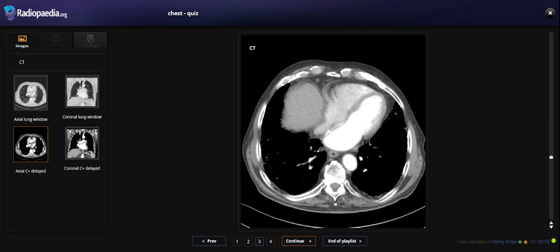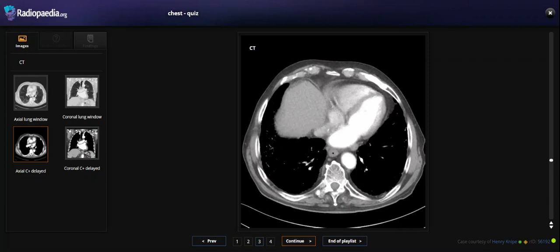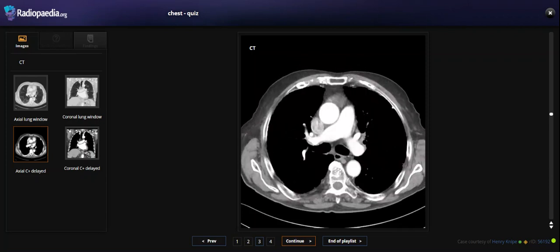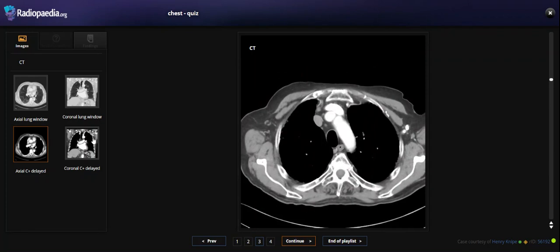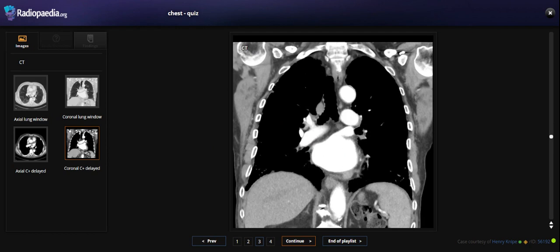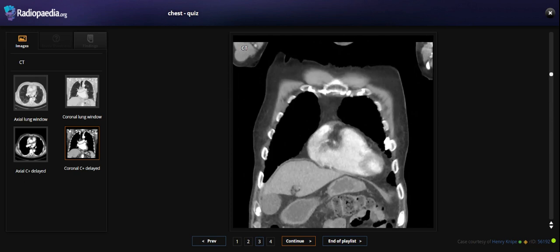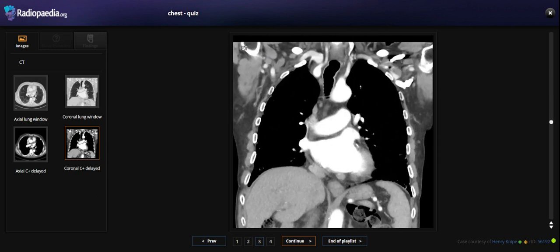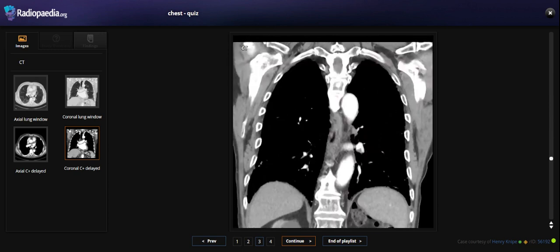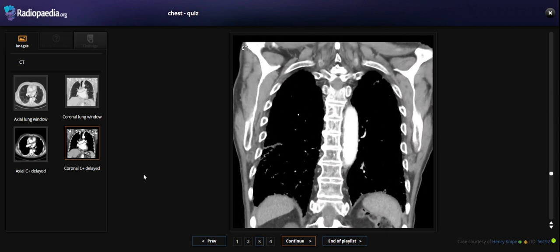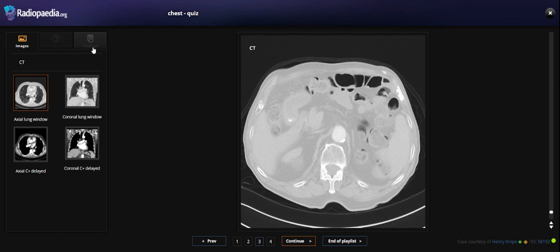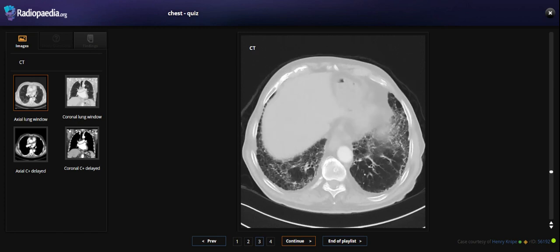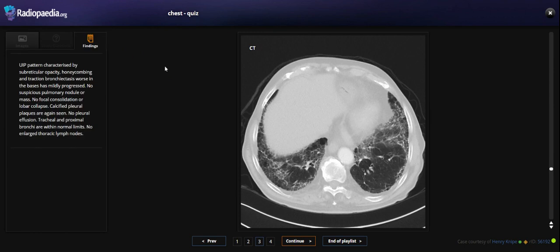So we don't see any intrapulmonary nodules. Looking at the mediastinal window, there is no abnormality in the mediastinum — no enlarged lymph nodes.